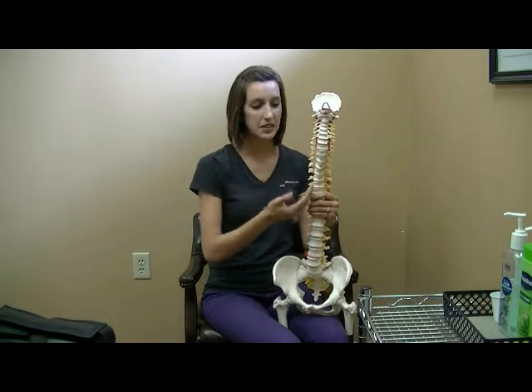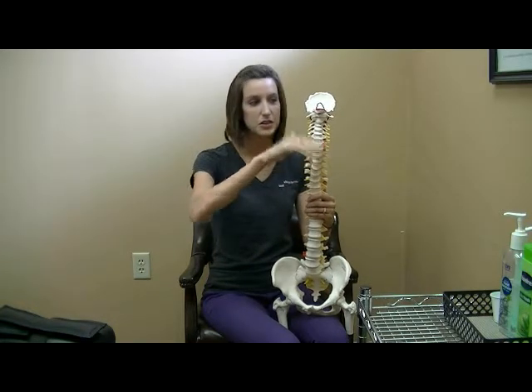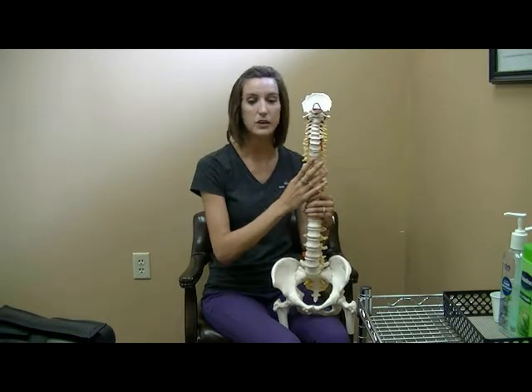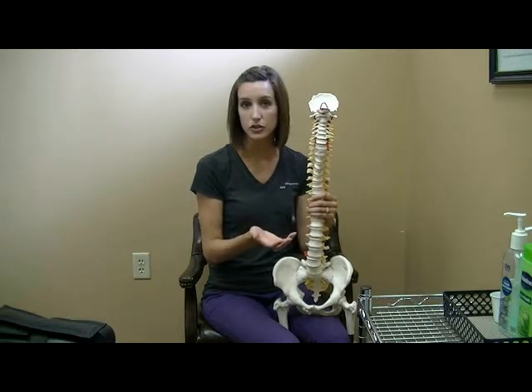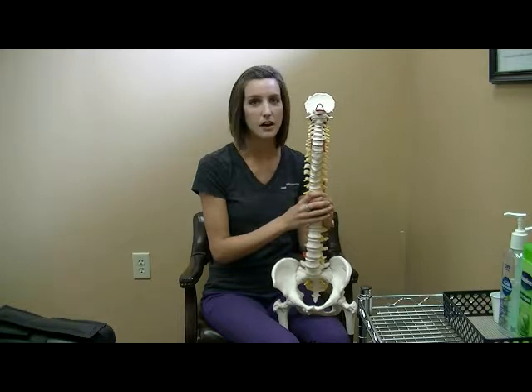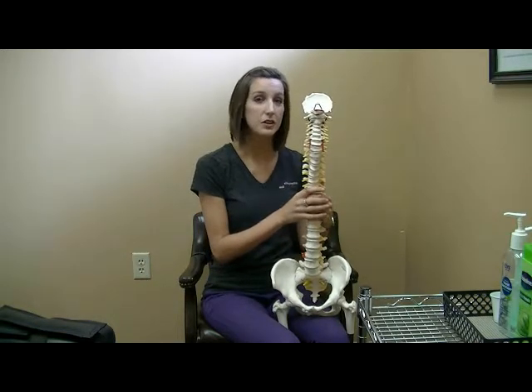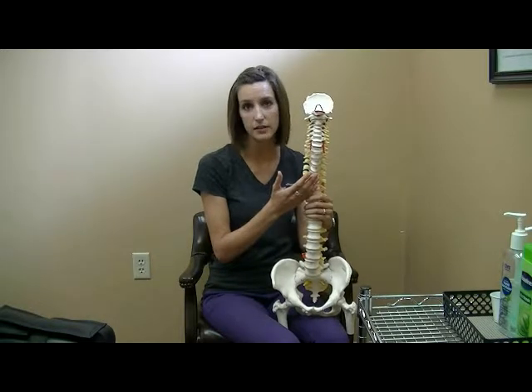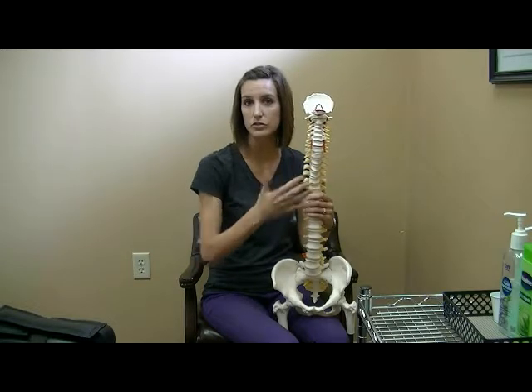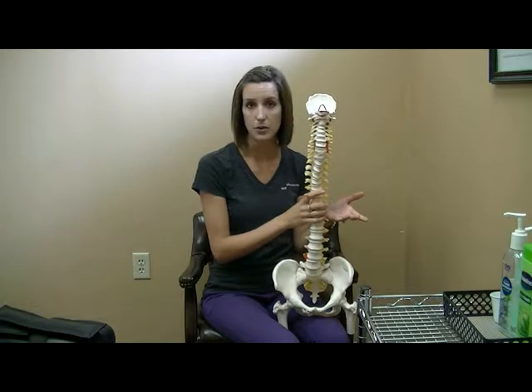We should see that everything is nice and straight up and down at the spine. It should be level across the shoulders. You should be nice and level across the base of the skull. So from a straight-on view, we can commonly tell if there is curvature. A common misconception is that all curvature is scoliosis. Scoliosis is a certain degree of curve. So you can have curvature without it being called scoliosis, and x-ray can really tell us that. That can explain some asymmetries that we might see across the shoulders, across the hips. That can also sometimes go along with some of the symptoms that we're having.